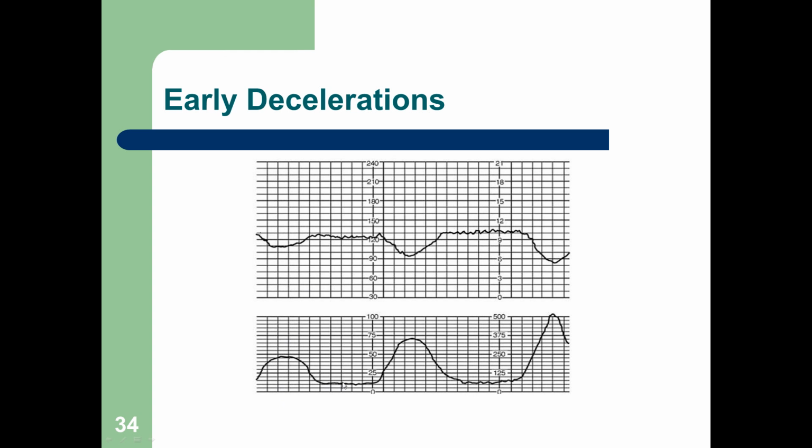Then we have some rest in between contractions. The heart rate comes back to the baseline. Then we have another deceleration. There's your contraction, okay? And then we go back to our baseline, so we're recovering. As the uterus is resting, the fetus is resting. They go back to their state. Okay, so now you're probably thinking, wow, that dropped down a little bit. So we're going to continue to monitor, but we're probably not going to let that go on for very long, okay?